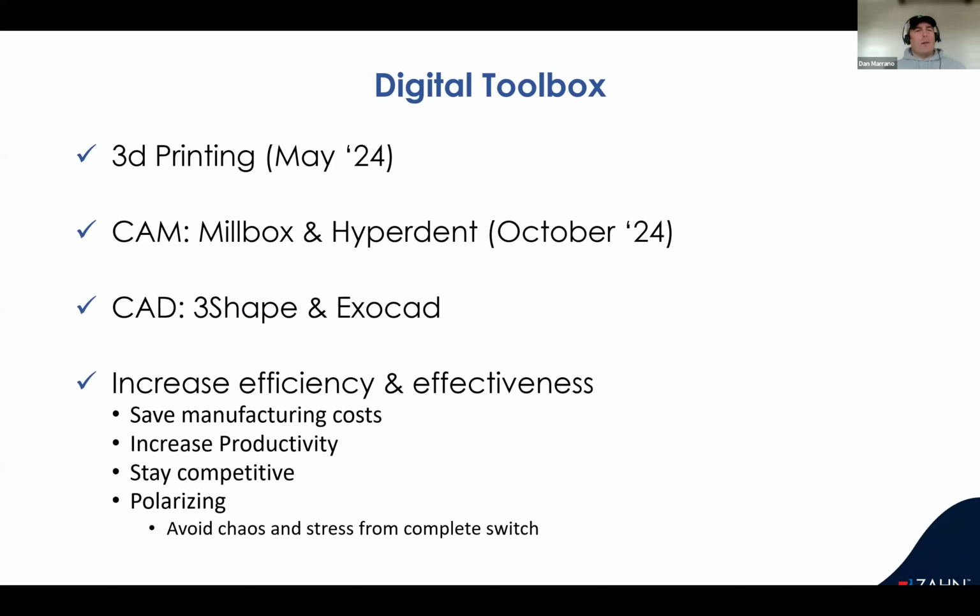I think it was my brother that said not too long ago, when they said, "Do you guys use exocad, or why don't you switch to exocad?" And he said, "In a large entity, could you imagine dumping this on my team? We would have a mutiny." So you can roll in both, whether you're one way or the other, and still get through an easy day without having people bicker about switching.